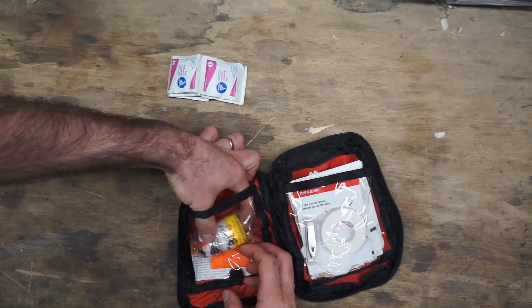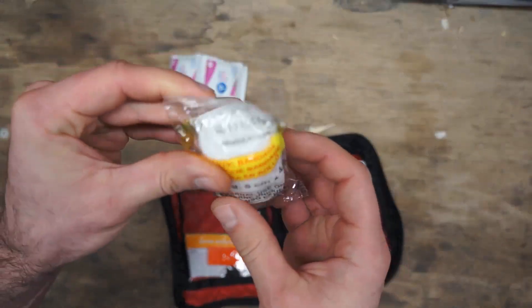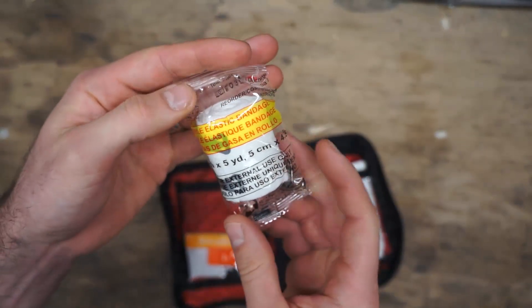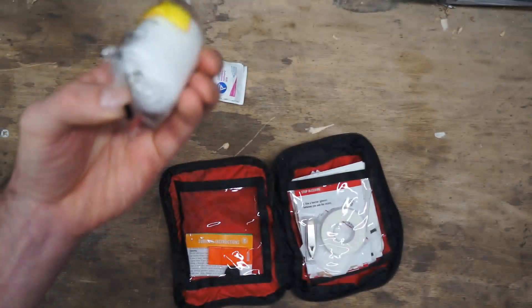Next up there's a two-inch by five-yard elastic bandage with keepers — very similar to what you'd find with an ACE bandage, but a little lower quality, more of a one-use type item.